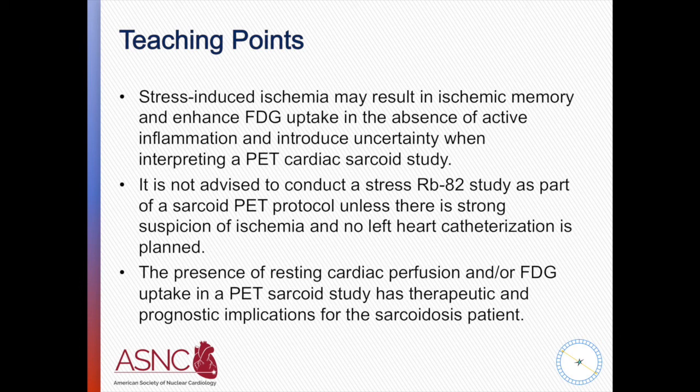You think of systemic diseases as being diffuse, involving a whole organ, but the reality is it can be very localized. Sometimes the RV can be involved over the LV. We've seen a few cases where you can actually get atrial uptake. So very good points in terms of the patterns. Next point.